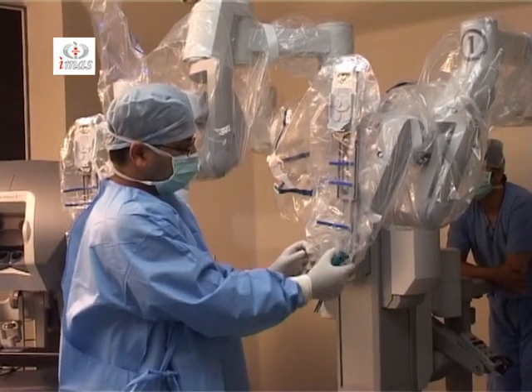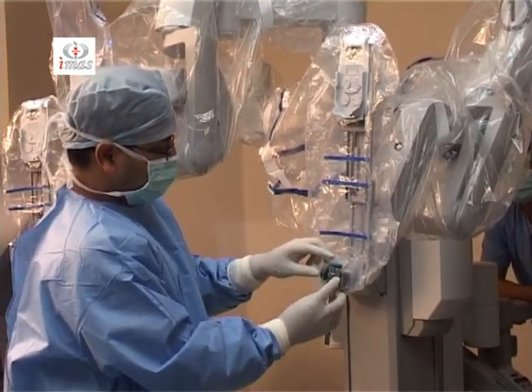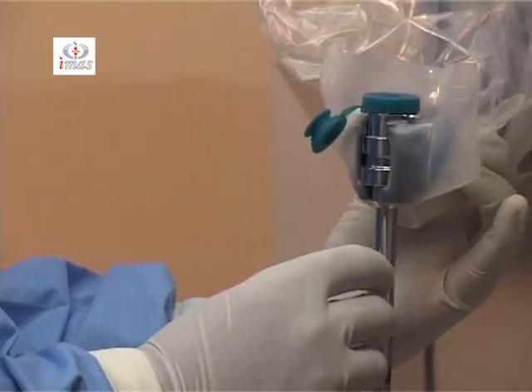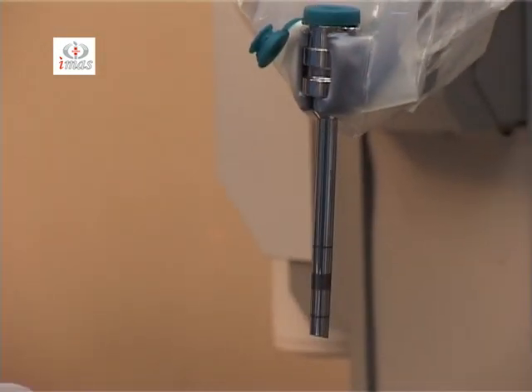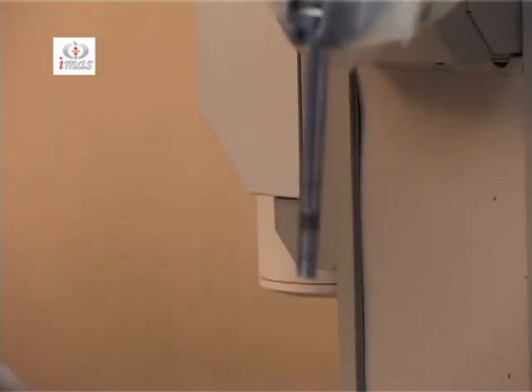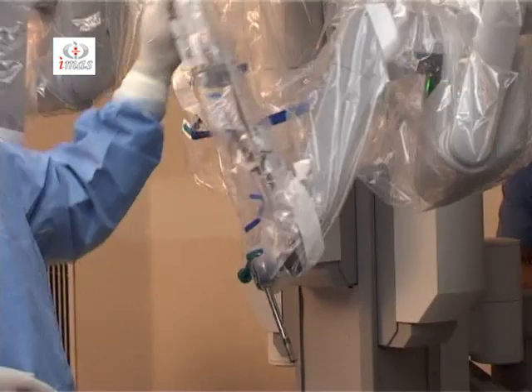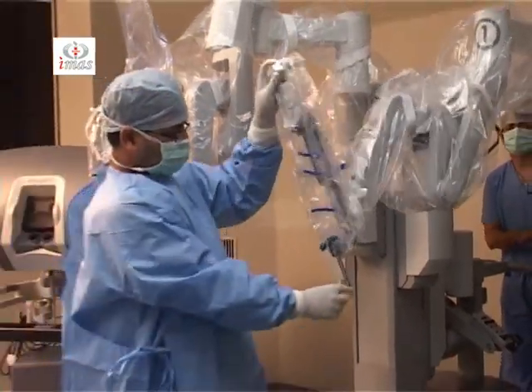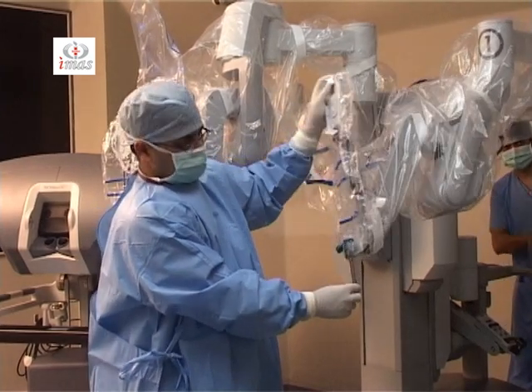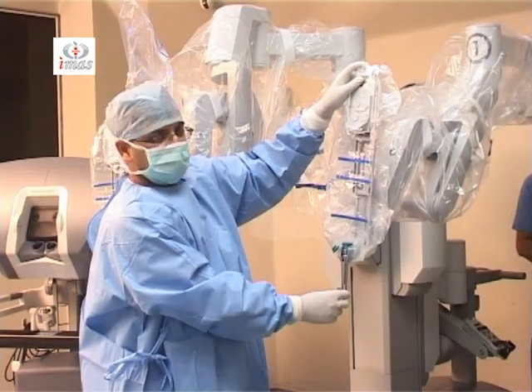In order to demonstrate the remote center technology, if we place this port here in the cannula mount, and now you fix your vision onto this thick black band. Howsoever I may move this arm, this black band is not going to move in space. So there is no pressure exerted onto the patient's body. This is what is meant by remote center technology.